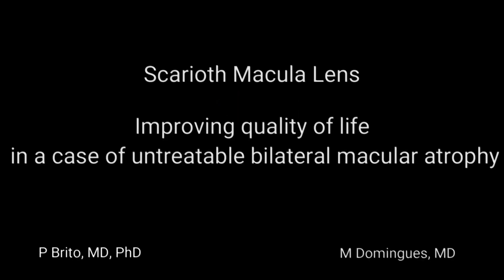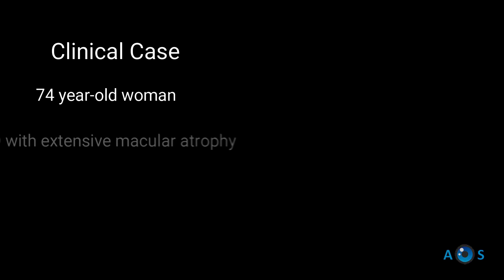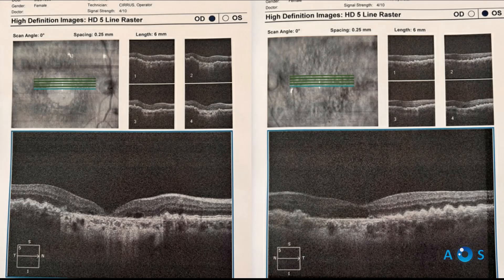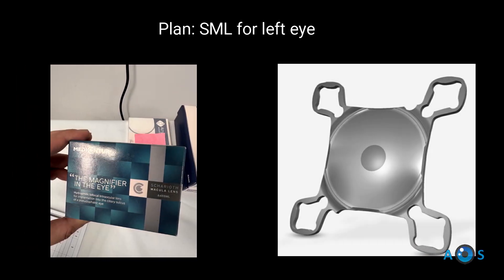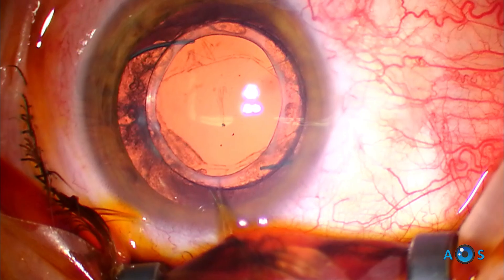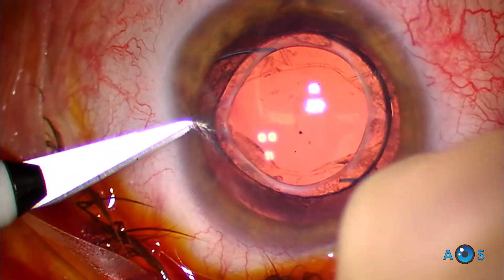In this video, a patient with bilateral macular atrophy undergoes implantation of the Scarioth Macula Lens. This is a supplementary intraocular lens designed to be implanted in the ciliary sulcus of pseudophakic eyes, acting as a magnifier within the eye. It enhances near vision in patients with advanced macular disease, enabling them to read and perceive details more effectively.